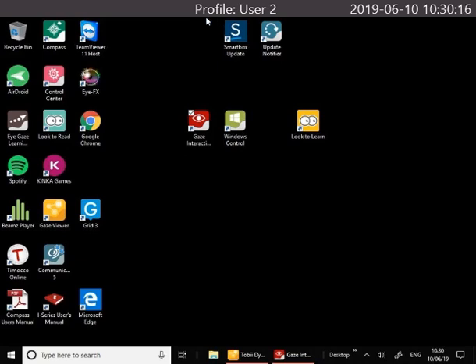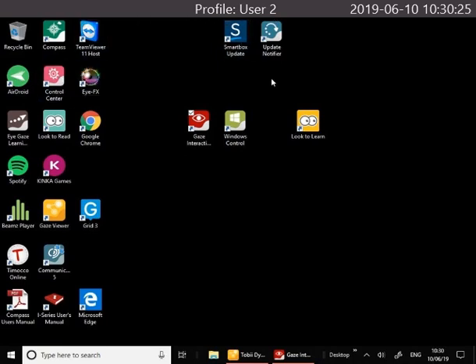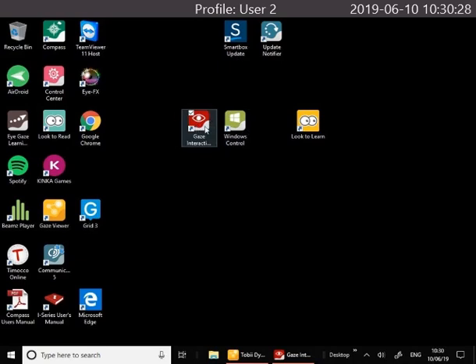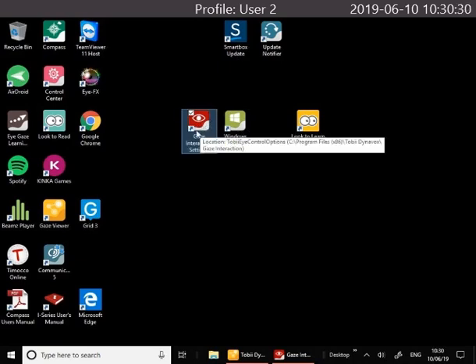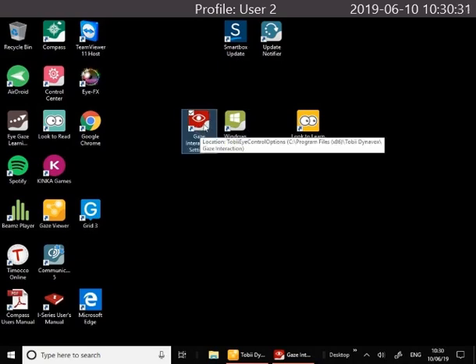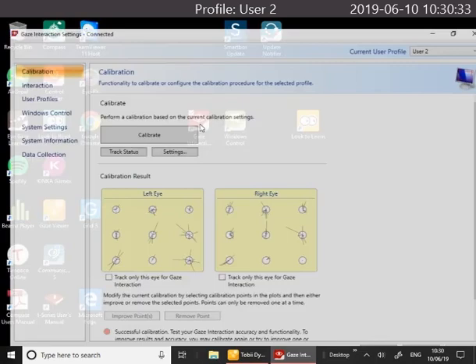When you first get the device you need to turn it on. The power button is on the left hand side along with the volume buttons. Once your computer is fired up you can go into the Gaze Interaction Settings. This is the red icon on the desktop of your screen.